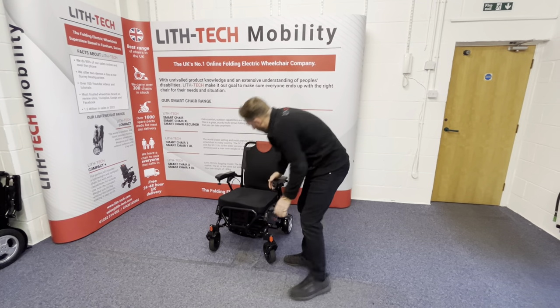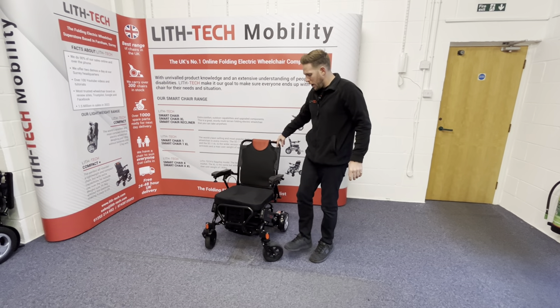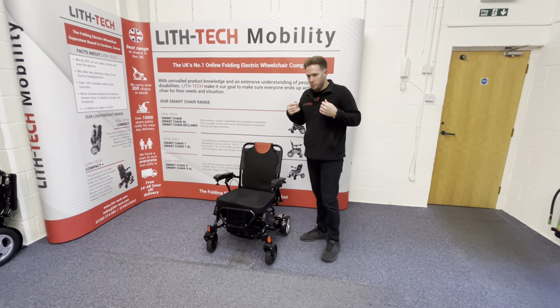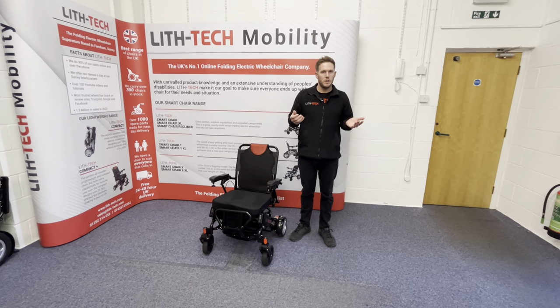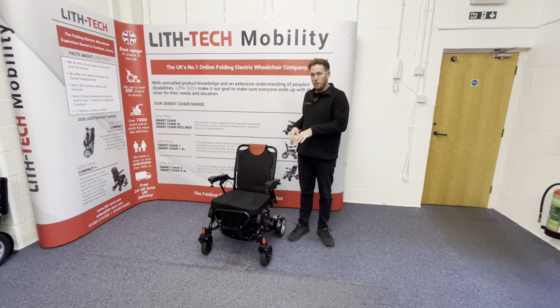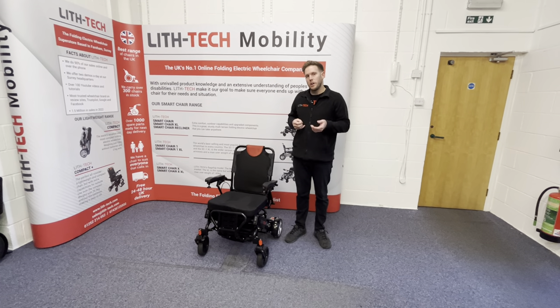On this new model we've got eight-inch back wheels and seven-inch front wheels, both rubber. Rubber is a more expensive compound — that's why a lot of cheap chairs use polyurethane PU tyres. Rubber is completely puncture-proof, much more grippy, and going to last you much longer.